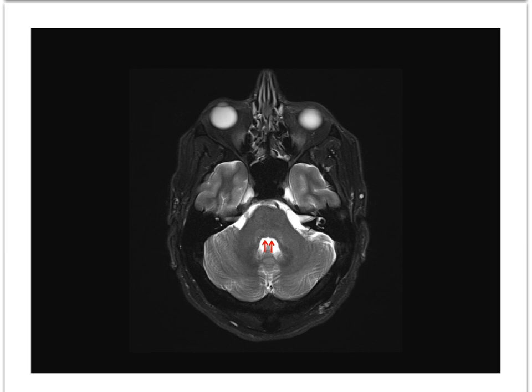At this same level, slight bumps at the floor of the 4th ventricle represent the facial colliculae. The trigeminal nerve on the right side can be seen exiting from the anterolateral upper pons. Slight imperfections in patient positioning have made the left side trigeminal nerve not lie in the same plane. These fluid-filled spaces along the posterior and lateral aspect of the cavernous sinuses are the Meckel's caves, through which the trigeminal nerve passes.